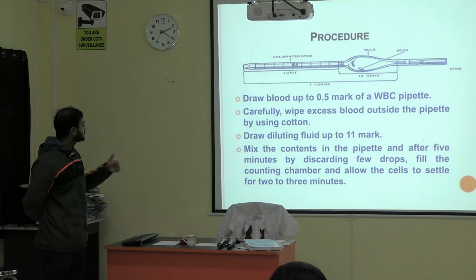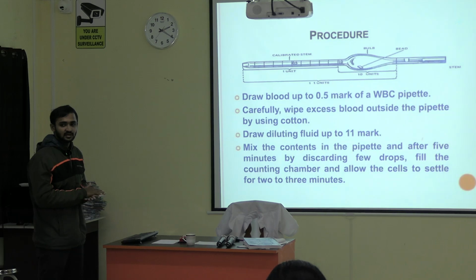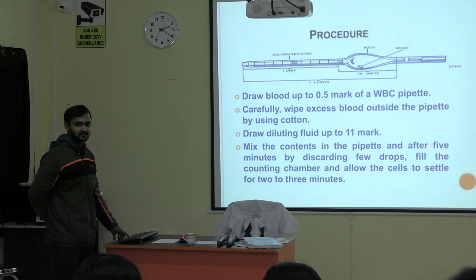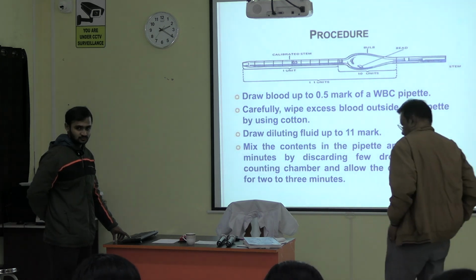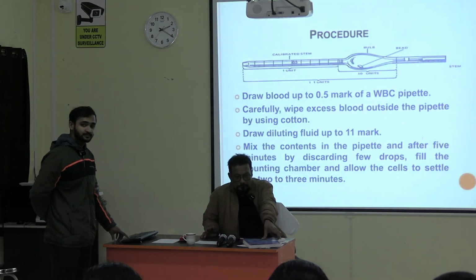Then we will mix again. We'll keep it in a horizontal position for a few minutes and mix. Then we need to discard 2 to 3 drops. After that, we will go for charging.